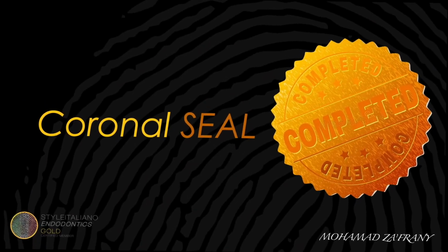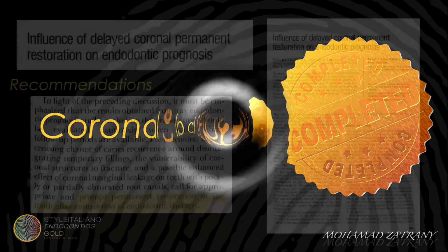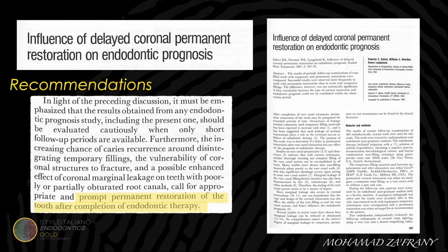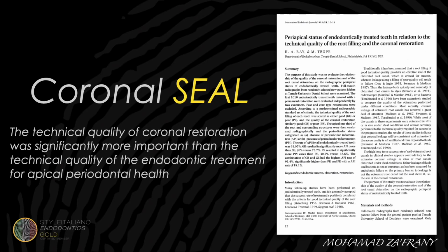Last but not least, when I speak about obturation and 3D sealing, I can't ignore confirming the importance of prompt final coronal seal. Coronal seal is very important to avoid leakage from the temporary filling through the oral cavity, especially over a long period, as I can't consider completion of endodontic treatment until the tooth is restored to function.